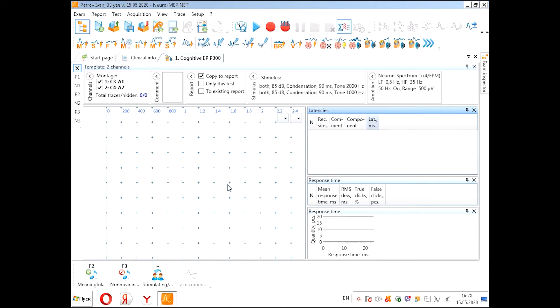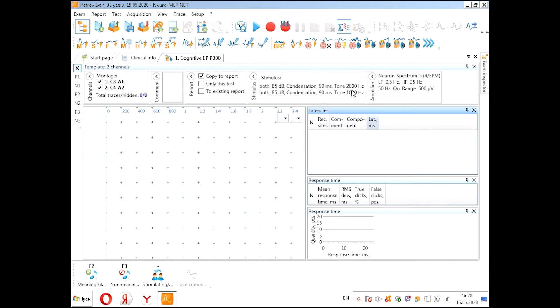Now we can see the template for this test. Our stimuli will be 85 decibels for both stimuli, and the frequency of meaningful and non-meaningful stimuli. The filters that we use, the channels that we use.